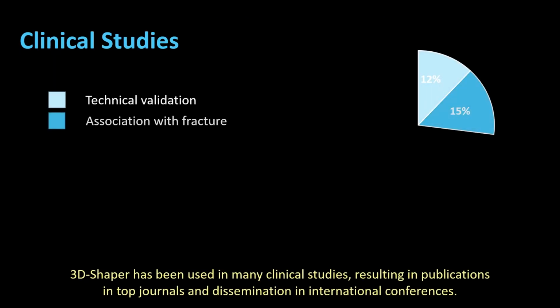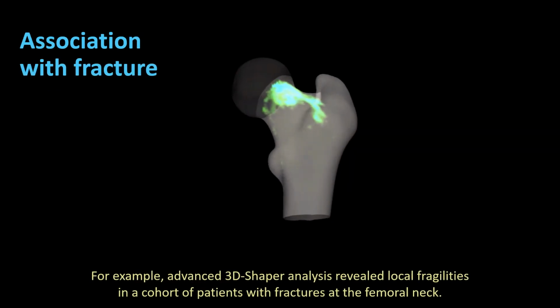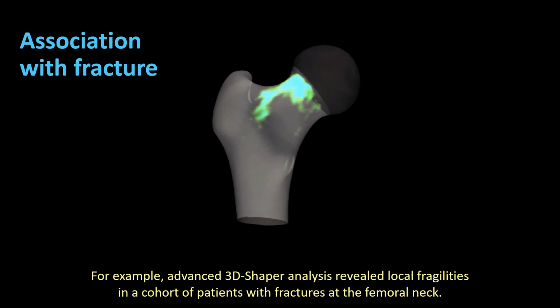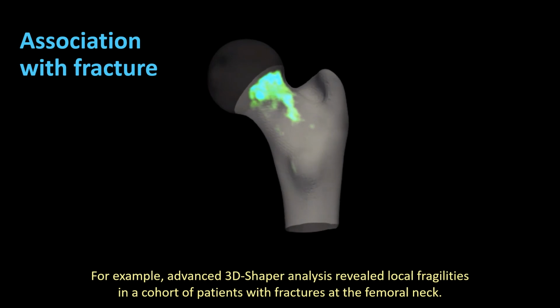3D-Shaper has been used in many clinical studies, resulting in publications in top journals and dissemination in international conferences. For example, advanced 3D-Shaper analysis revealed local fragilities in a cohort of patients with fractures at the femoral neck.